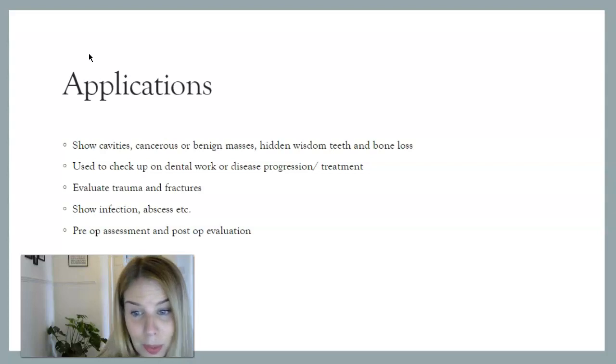So pretty much all of you probably have had a dental x-ray at some point. You go to the dentist, they think you might have a filling or whatever it might be, and they will give you an x-ray of your teeth. So it shows any cavities, but it also can help show any maybe cancerous masses or benign masses that might be within the mouth. People might have hidden wisdom teeth that are causing them issues.